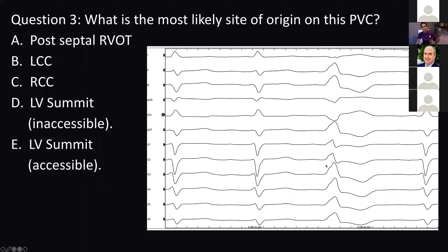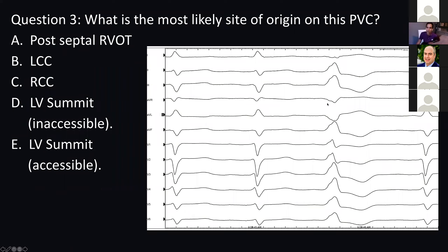In terms of differentiating between the accessible and inaccessible, we looked at the right bundle branch pattern, which is more suggestive that it's more lateral — closer to the left ventricle rather than the right ventricle. The other thing is the Q wave in AVL is bigger than the Q wave in AVR, which is also suggestive of a more lateral focus. So this is more typical for the accessible LV summit region rather than the inaccessible region.